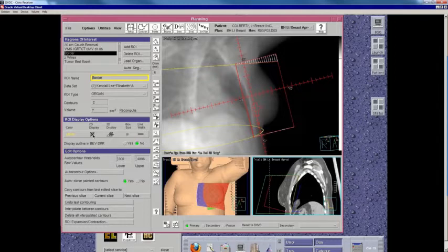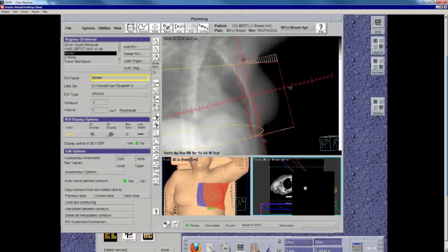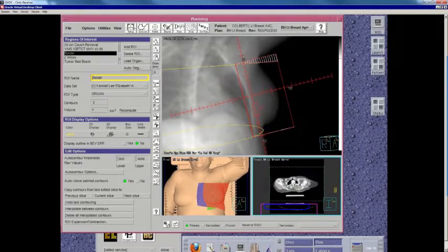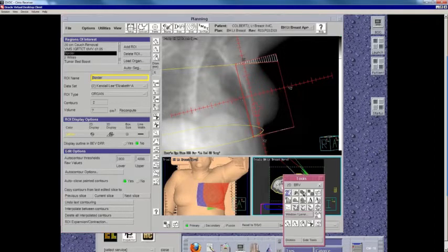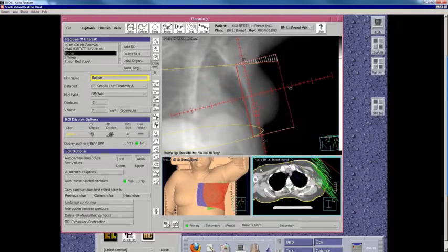And how do we do that? Well, we define a circular contour at the match line, which I've shown here in yellow. And we call that a border, just to show you that on the axial slices. Why did it show up on the axial slices? There we go. So this is just a very simple, easy way to do it. So we've created this single contour, which is a ring.